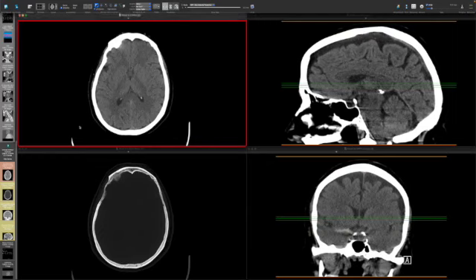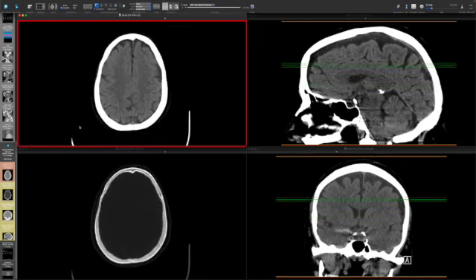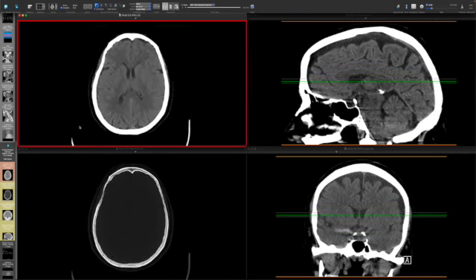Hello, this is Dr. Eric Peterson. We're going to go through case number 9220 and talk about some of the findings on the non-contrast head CT.